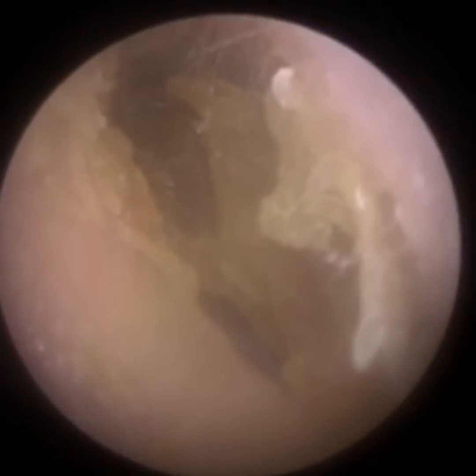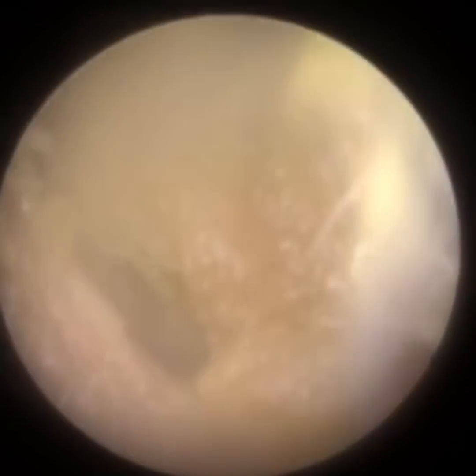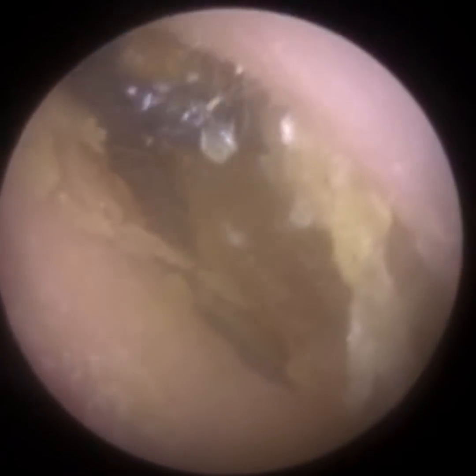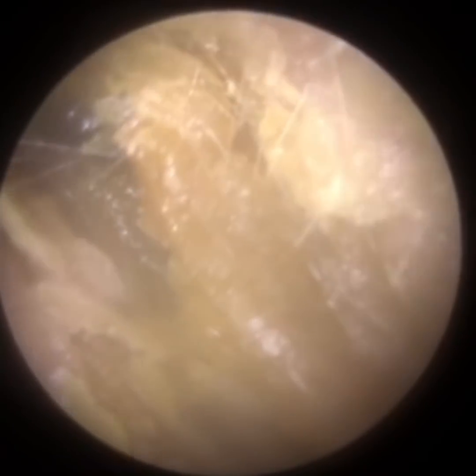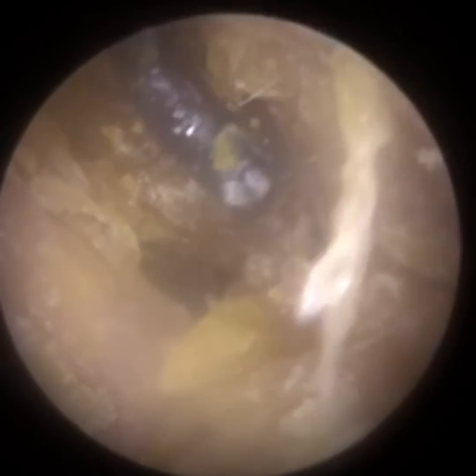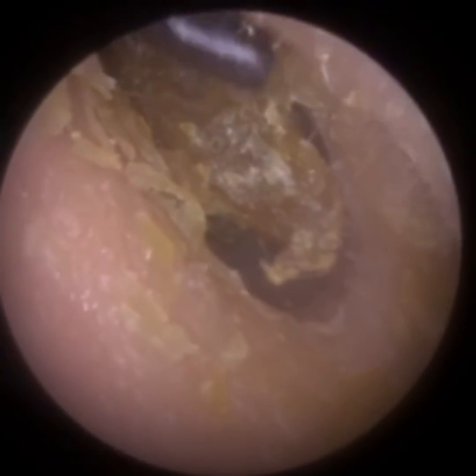So this is patient three. Just started off with suction at the entrance, but their ear temperature is quite higher than usual, which caused a bit of misting of the lens initially. I soon realised suction's not going to be the right tool, so I'm using an ear hook, trying to get in and behind this dry piece of wax. There's a flake of skin there as well.